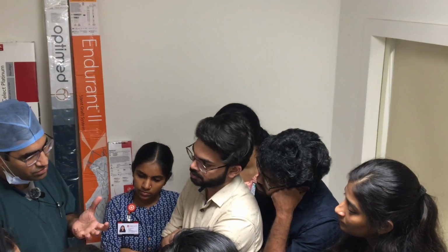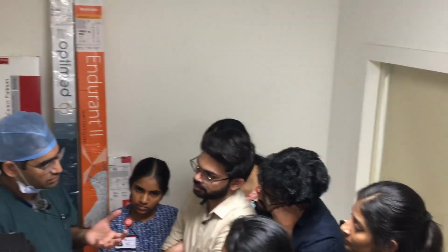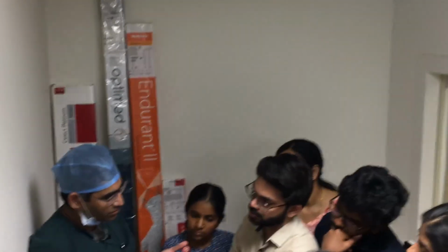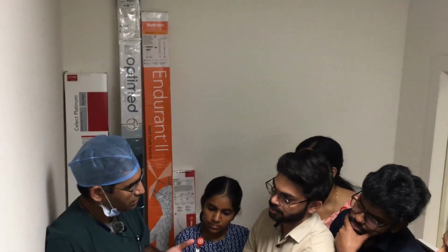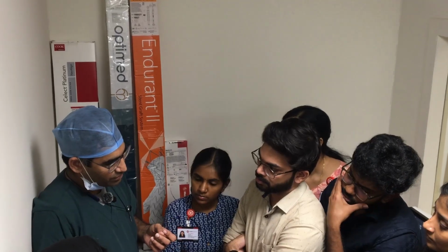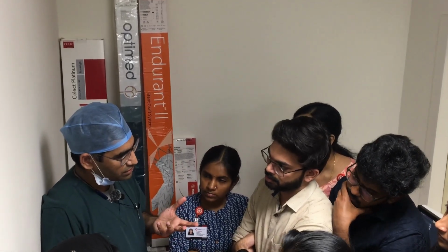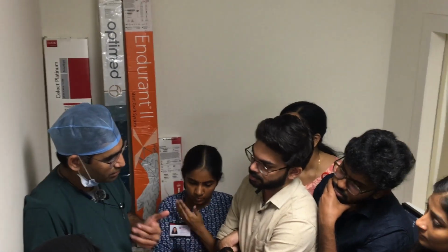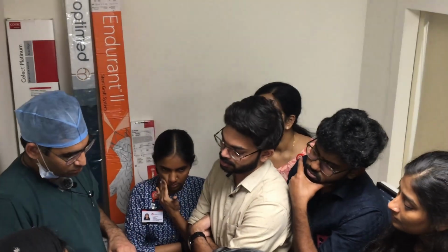Ideally you should use 1:1. If it is a 4 vessel, you have to use a 4 balloon. 5 vessel, 5 balloon. As per that, many times if the patient is old with diffuse atherosclerosis, we undersize because oversizing can produce dissection, and then more problems.